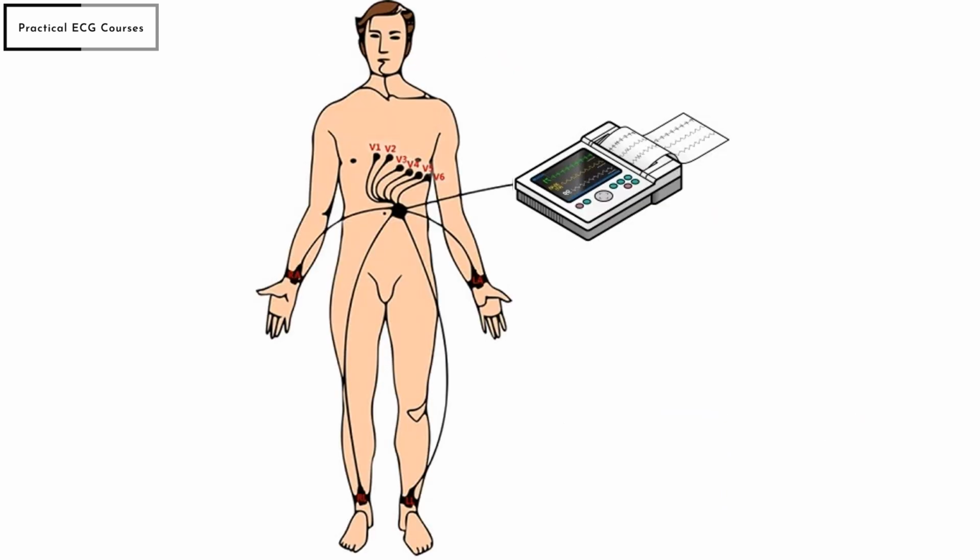We all know that we use 12-lead ECGs. So why do we need 12 leads? You must remember that the heart is a three-dimensional organ, and so the vectors within the heart are also traveling in three-dimensional space. So to be able to pick up all the vectors, you need to have a three-dimensional perspective.